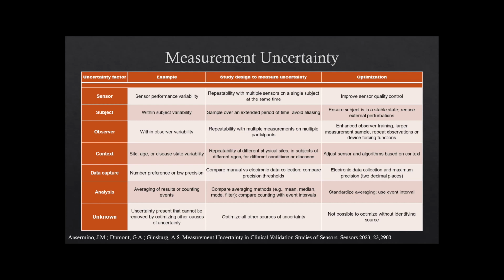So we really came up with some ideas for each of these causes of uncertainty, to look at how we could design studies and ask specific questions to try and address this. The reason for doing that is that we can then put all of these measures of uncertainty next to each other and look at the different impact that each has. And remember, each of these measurement uncertainties has a different distribution. Some may be normally distributed, but a lot of what we look at in pulse oximetry is not. It has a skewed distribution, it's time varying, and it also varies depending on the oxygen saturation level.